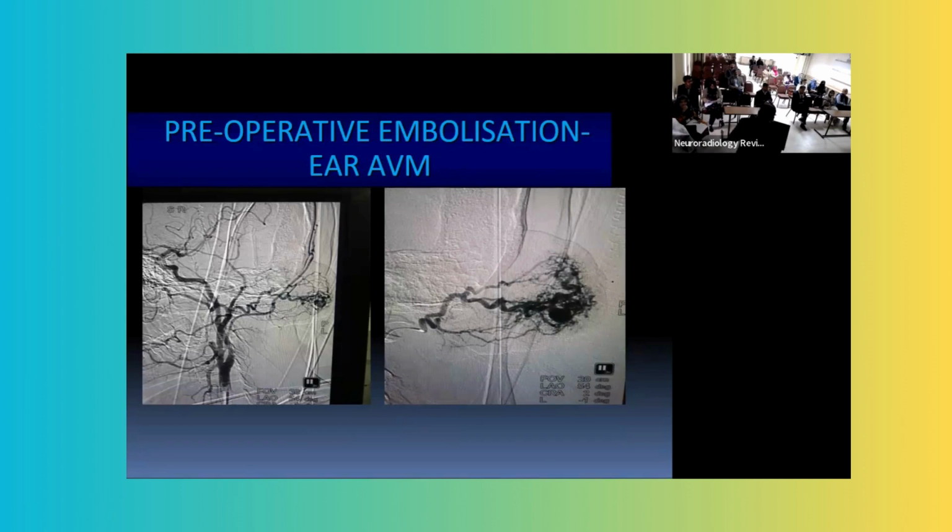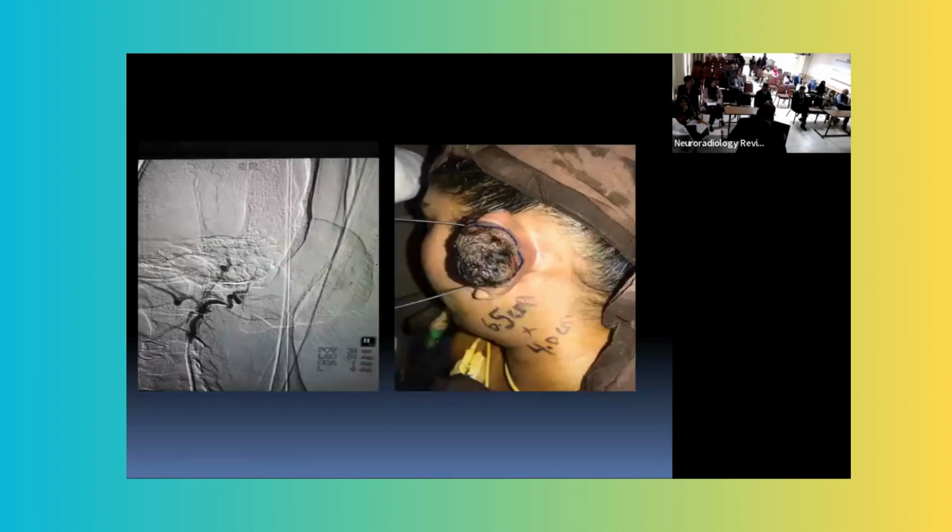Conventional cerebral angiography showed the nidus of the AVM, and also a pseudoaneurysm within the sac. The imaging appearance and knowledge of the vascular anomaly is very important for the treatment. In this case, I used fill with PVA particles.